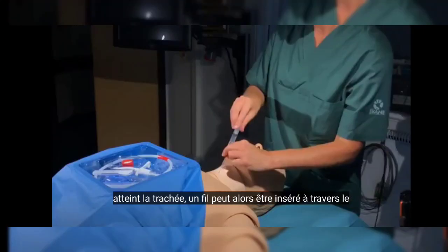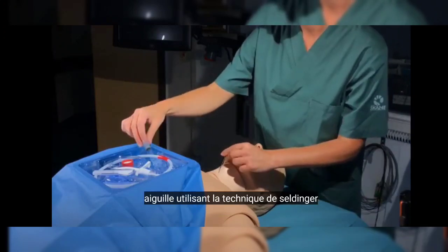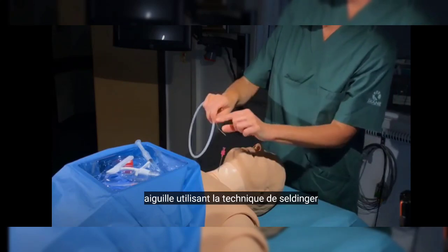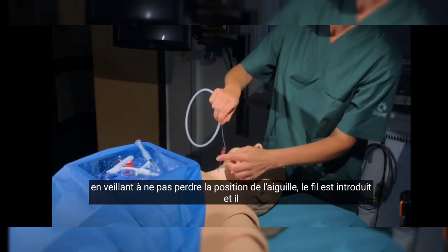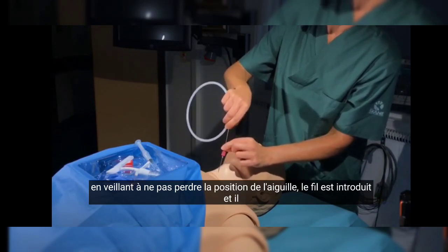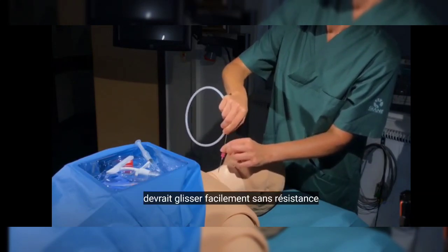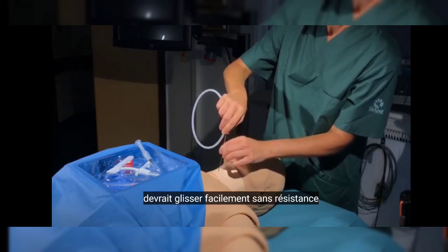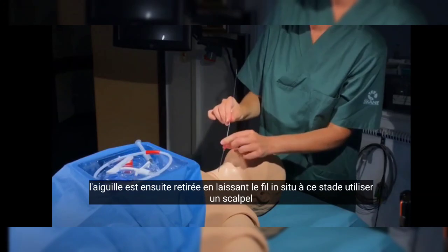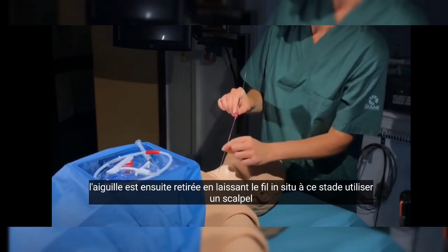A wire can then be inserted through the needle using the Seldinger technique. Taking care that the needle position is not lost, the wire is introduced, and it should glide easily without resistance. The needle is then removed, leaving the wire in situ.